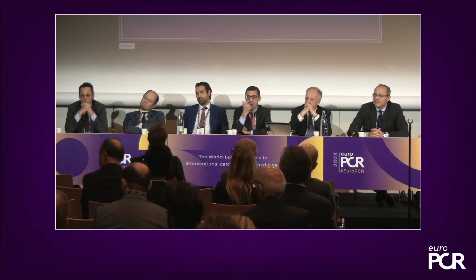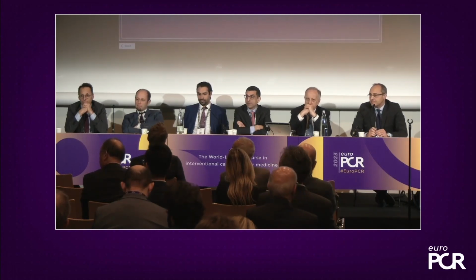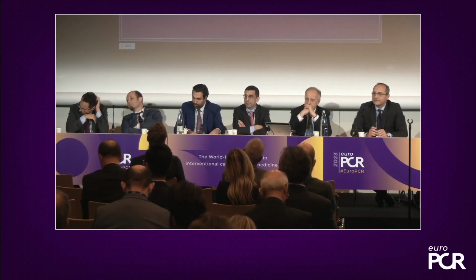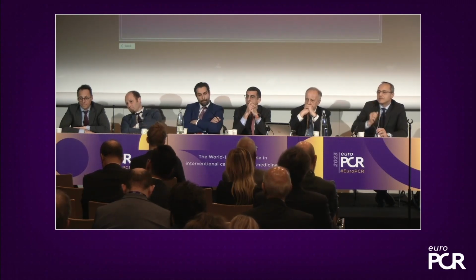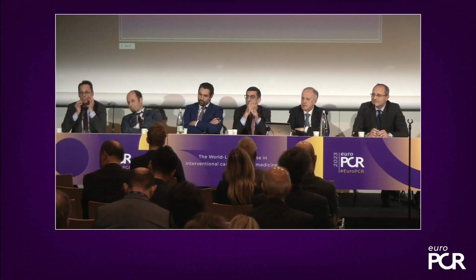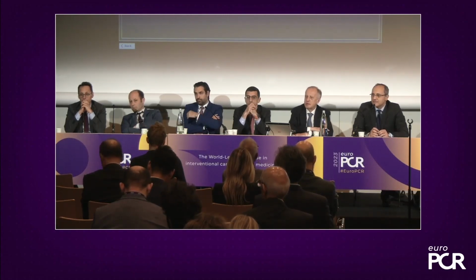I think we have to use it. We have plenty of experience of lesions that apparently are non-significant and become significant, and tight stenosis in a small area that become non-significant, and you can avoid the treatment. We have experience in both directions, so looking is deceiving sometimes. During intervention, when you have several serial lesions, you can use the physiological assessment, put a stent in the more severe stenosis, then repeat the assessment to see whether the proximal one becomes significant or not, and then keep on with the treatment. And of course, post-procedure is to be sure that the result is okay.